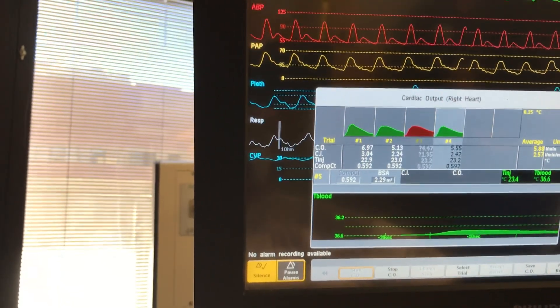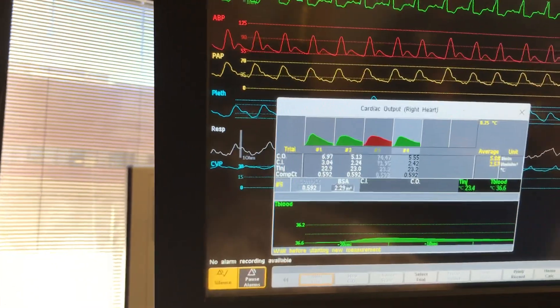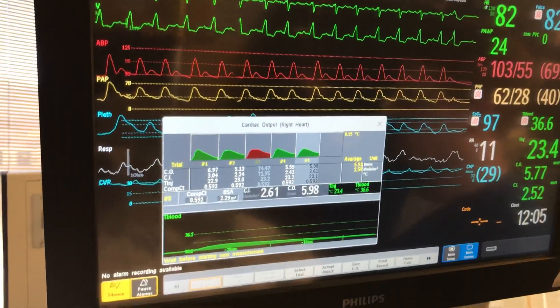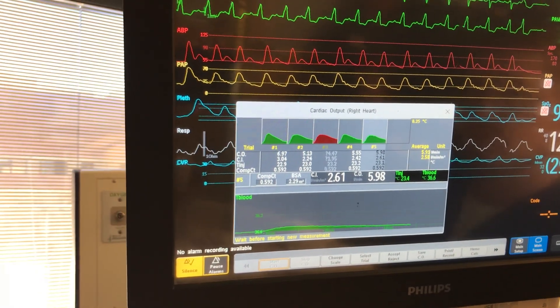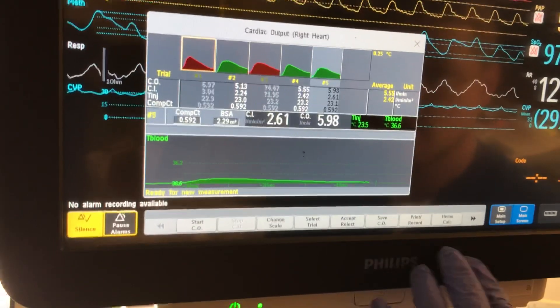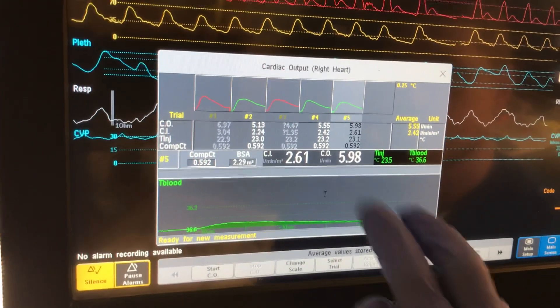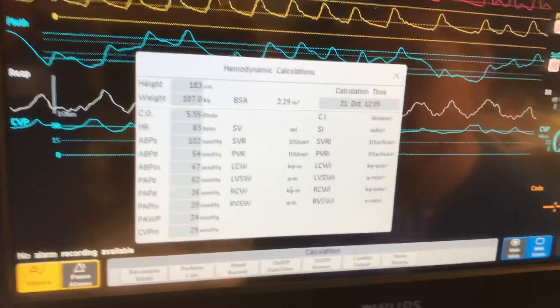So is this detecting the glucose? Detects the temperature. Temperature gradient — that's how it knows when it's coming through. 5.98. Take out that 6.97 for me. So those are in. The cardiac output is — all right, we're going to save cardiac output. So that will get your average. And then we do the hemo calcs. That puts in your — he gave me my cardiac output already. I put in 5.55.